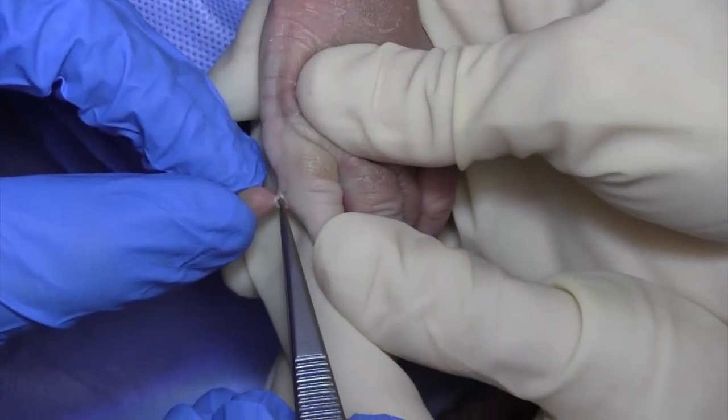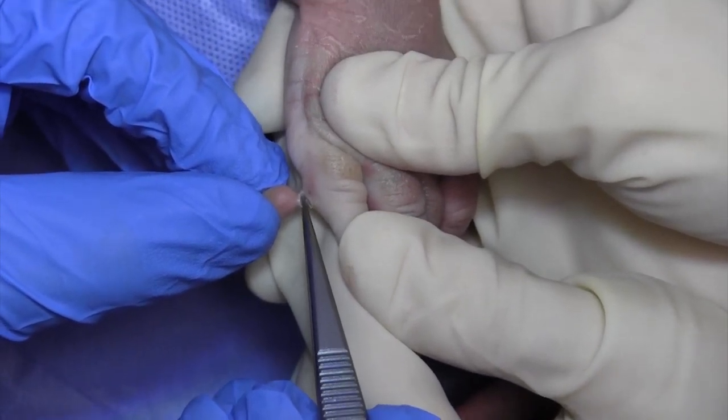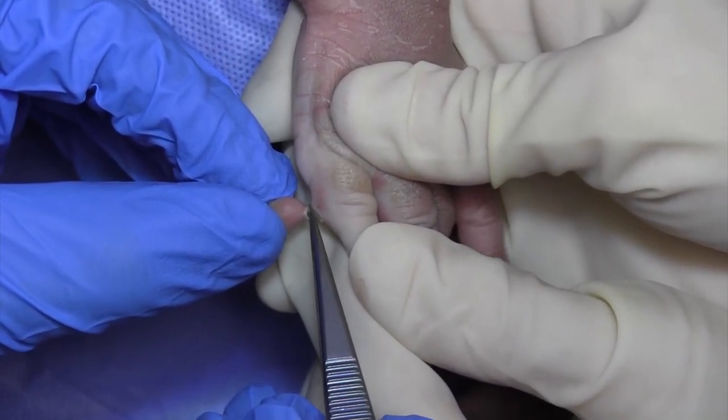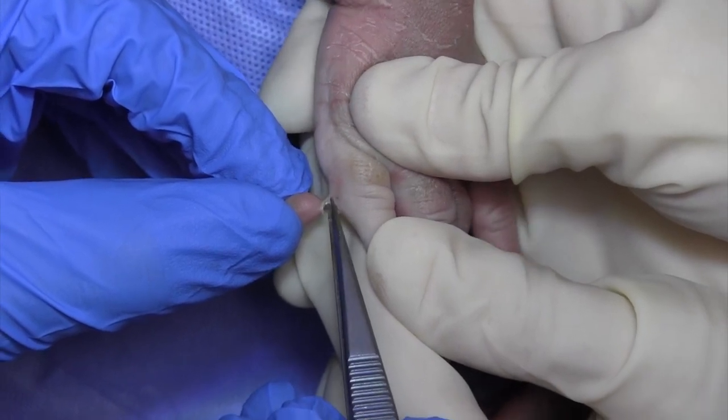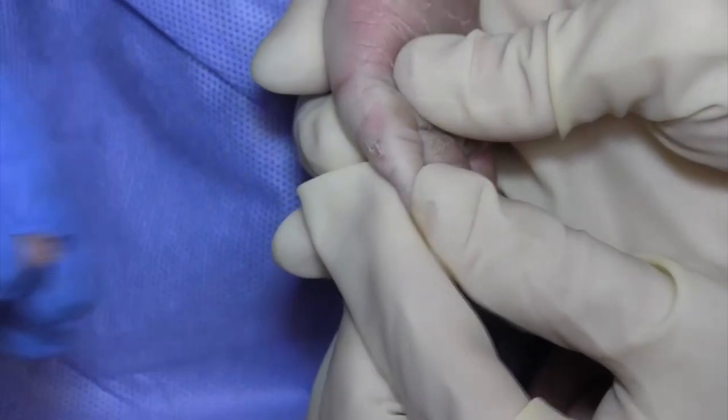We use a bipolar electrocautery to remove the polydactylous digit at its base, leaving a flat contour with no residual nubbin. We then apply bacitracin and a band-aid, and the child is seen two weeks later for a wound check.